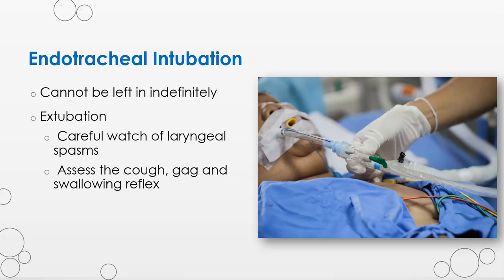ET tubes cannot be left in indefinitely, and a discussion will take place with the patient's family and the physicians regarding a tracheostomy if the patient still requires airway and ventilator support. Hopefully, the patient will only need temporary support and can be extubated in a timely manner.